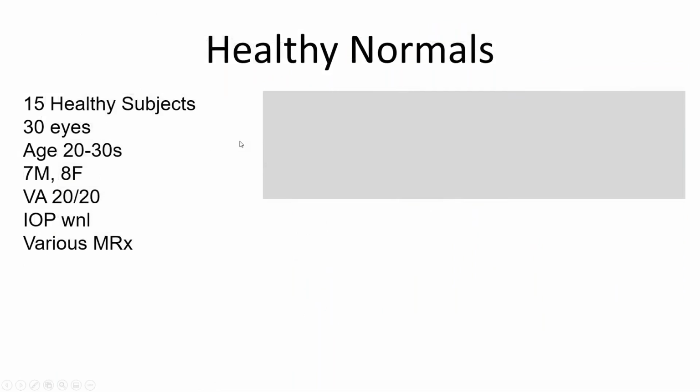So whenever using a new tool like a cone contrast threshold test, in this case I was using the Konan ColorDx HD CCT. There are other versions of it. This is a cone contrast threshold test which tries to quantify both color and contrast sensitivity in subjects relatively quickly, in about 7 minutes. So to use a test, you have to know how to use it correctly.